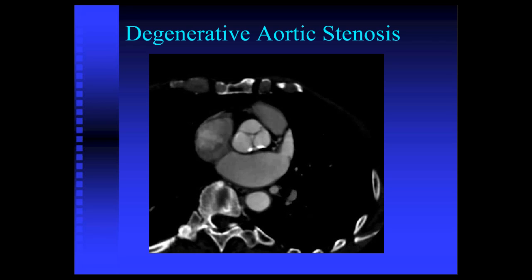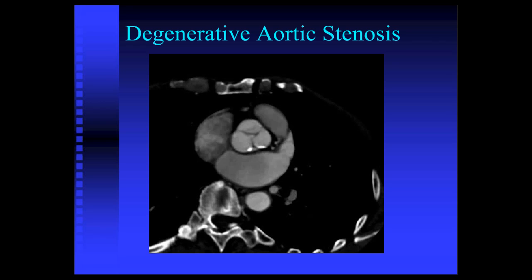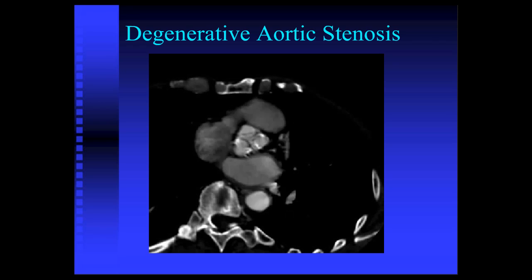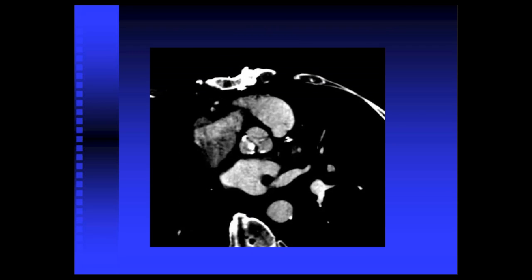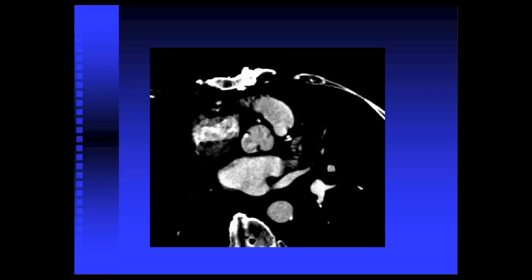With cine imaging, we can get real views of degenerative aortic stenosis. In this patient with moderate aortic stenosis, we can see the degree of calcification and the limited coaptation and excursion of the valve leaflets. In a patient with severe aortic stenosis, cine imaging shows the limited excursion of the leaflets, partial fusion between the right and left leaflets, and the limited excursion of the valve leaflet during systole.